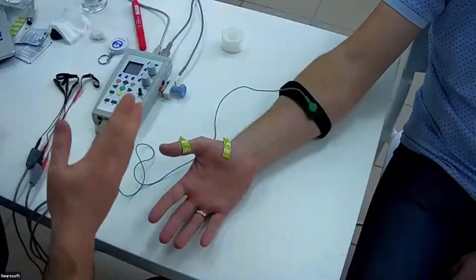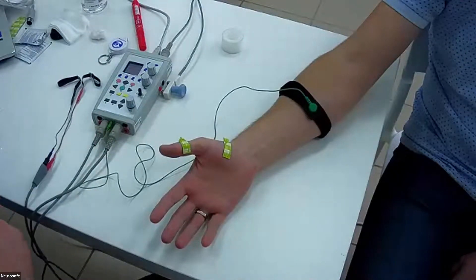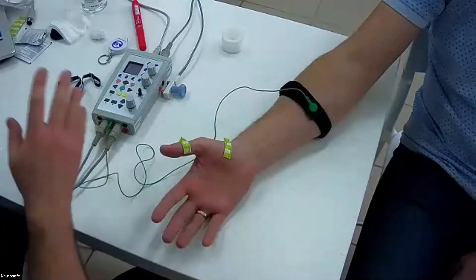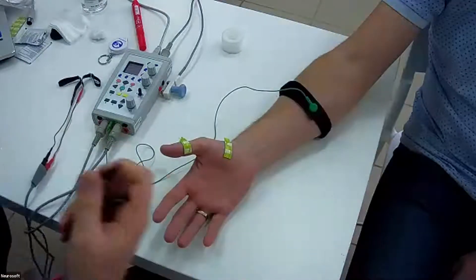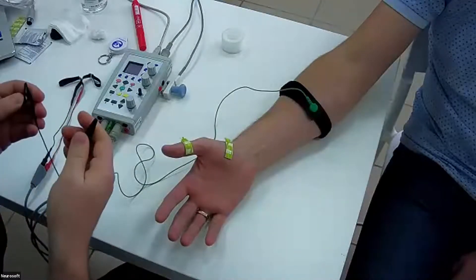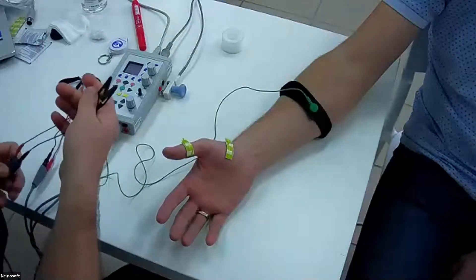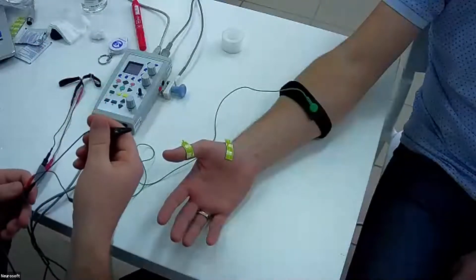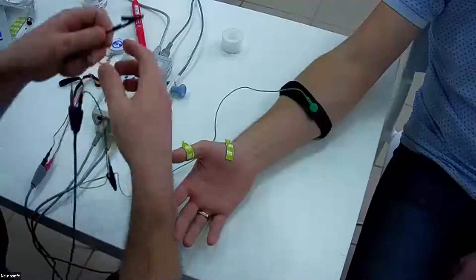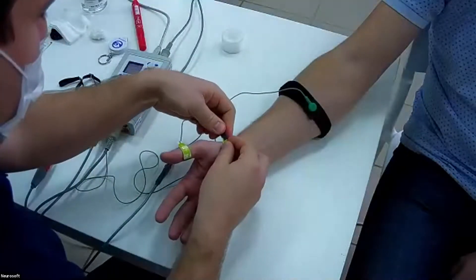For motor conduction studies, we use the first channel. We use alligator clips for that — the black alligator clip is the active electrode and the red is the reference E2. We set them accordingly.